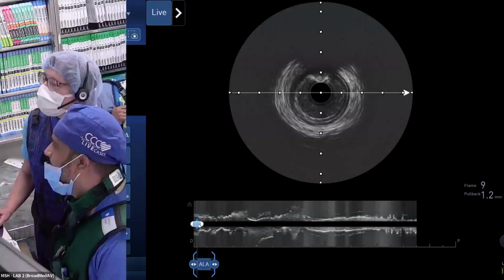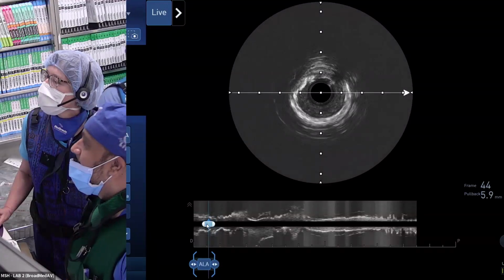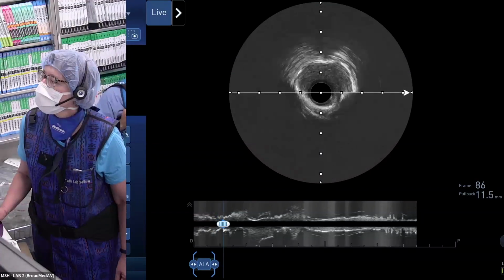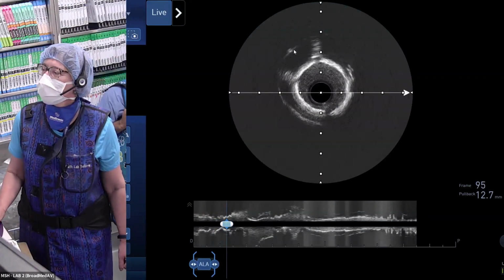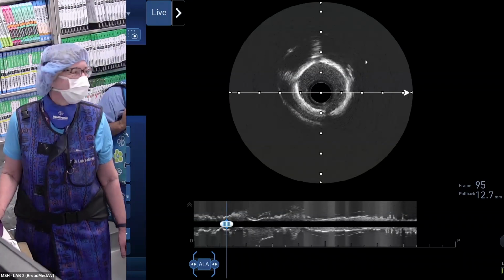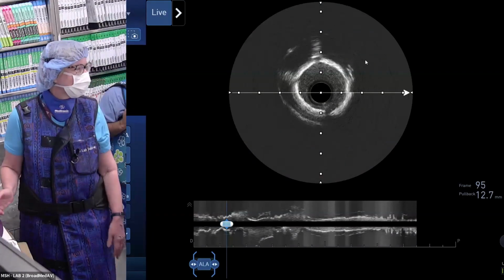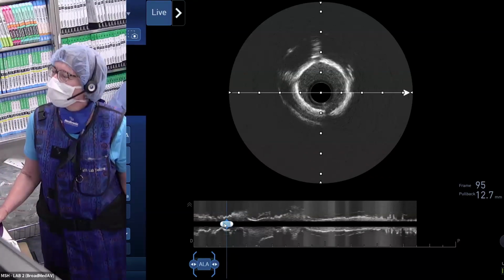Okay, who can analyze this? Tell us exactly what we have done or not done. Back to the calcium we saw right there. Pull back. These are the nice cuts. Look at that. Remember, earlier it was total circular. Now you have at least one, two, three cuts. Textbook. Three cuts, very clear. Beautiful. And three cuts correspond to the 3 blades of the 2.5. If the 3 plus has 4 blades, we would have seen 4 cuts. But nice. Wonderful.